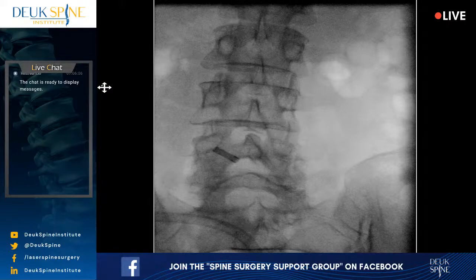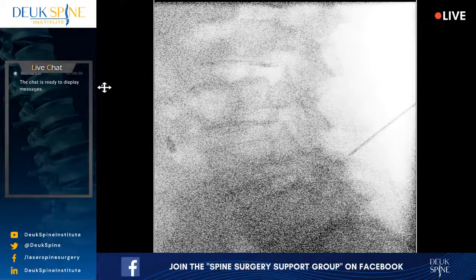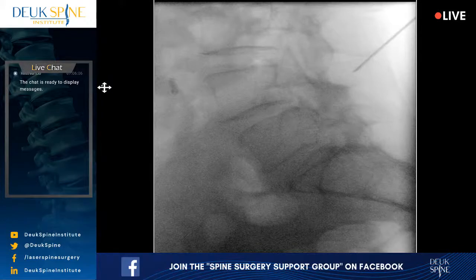Now, I have to navigate down to her damaged discs, and to do that, I'm gonna use an X-ray picture, lateral. And what navigation means is basically to guide a trajectory or path that goes from one place to another, okay? And for navigational purposes, we're gonna use the X-ray machine. X-ray machine is, in my opinion, the very best way to navigate through the spine. We need to drop the table a smidgen, about 1/4 inch. All right, Jordan, let's see if we can't get 5-1 lined up. We're going to start with L5-S1.